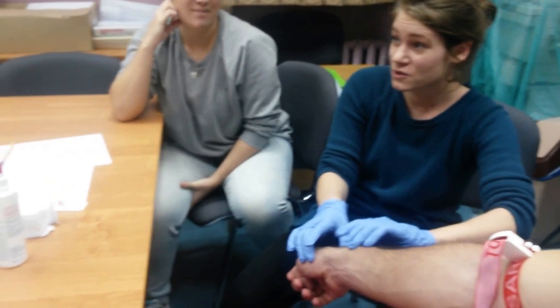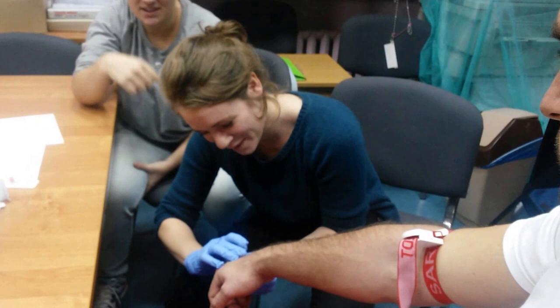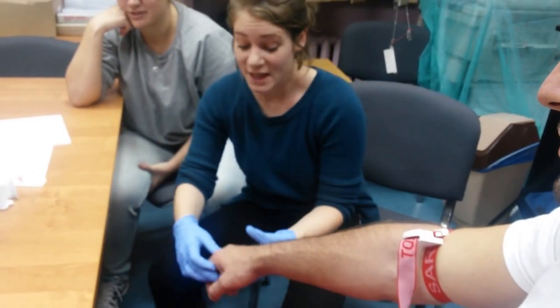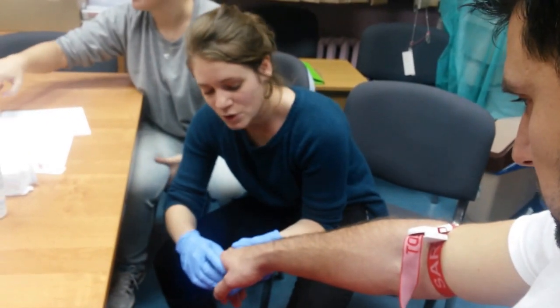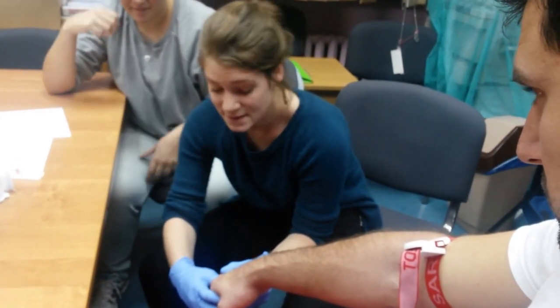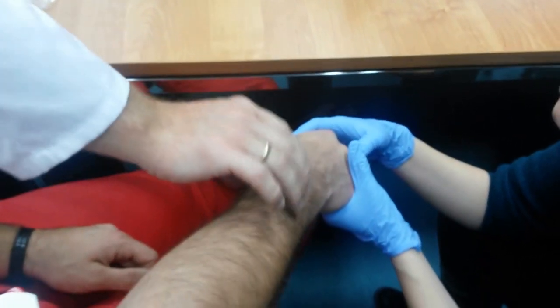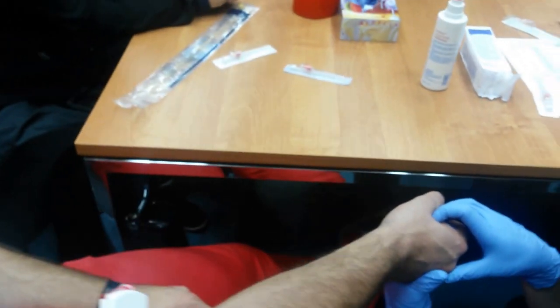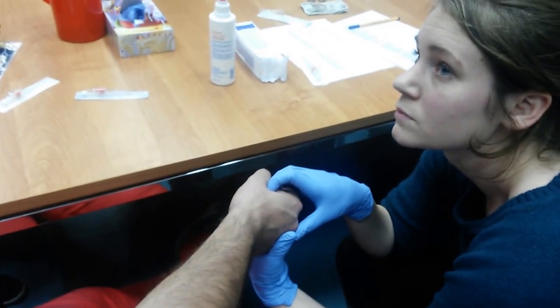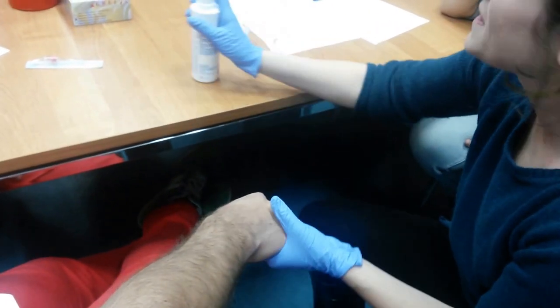You also have to push a little bit harder because the skin is thicker here. I'm going to do these ones because if I'm going to get anything, this is the one. It's important — when you hold the skin, tighten it to hold it in place. If you would like to choose this one, you have to be careful because here you have the arteria radialis, and you have to try to avoid it.